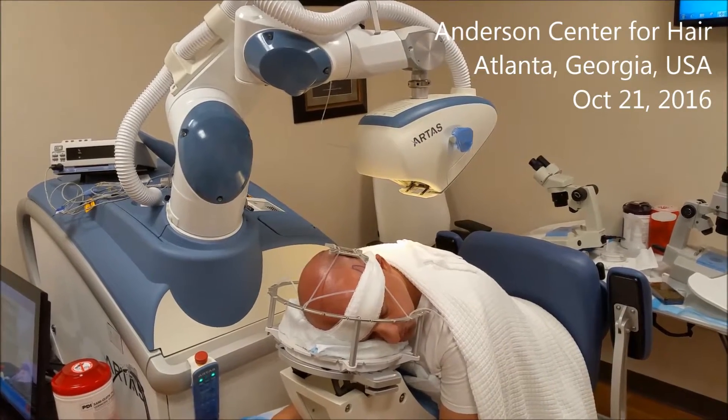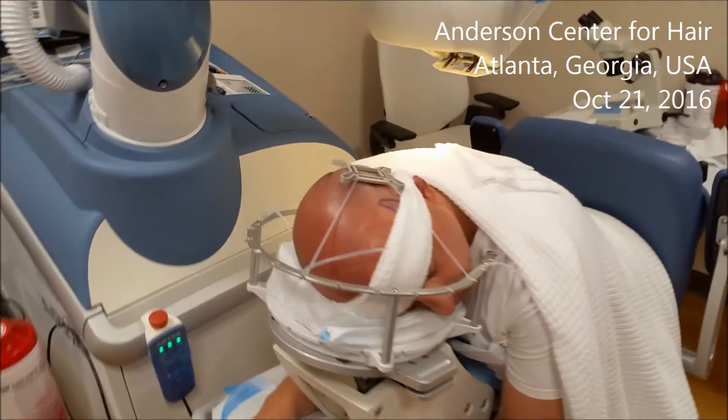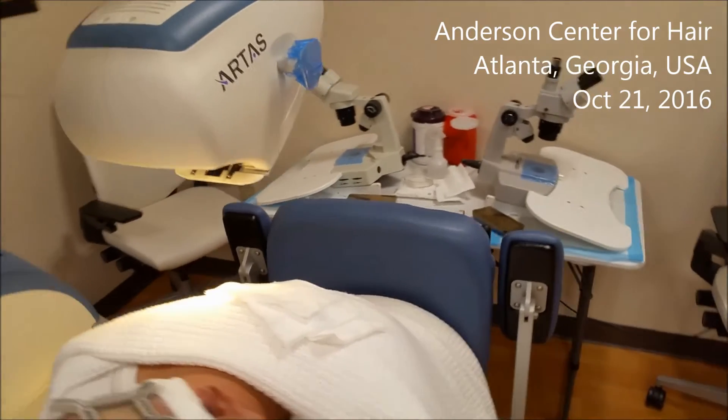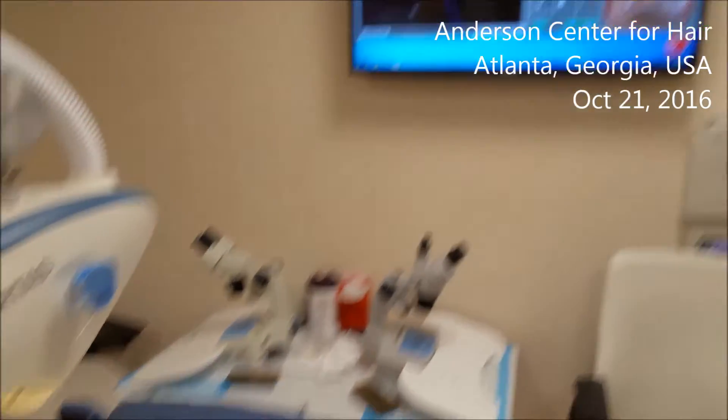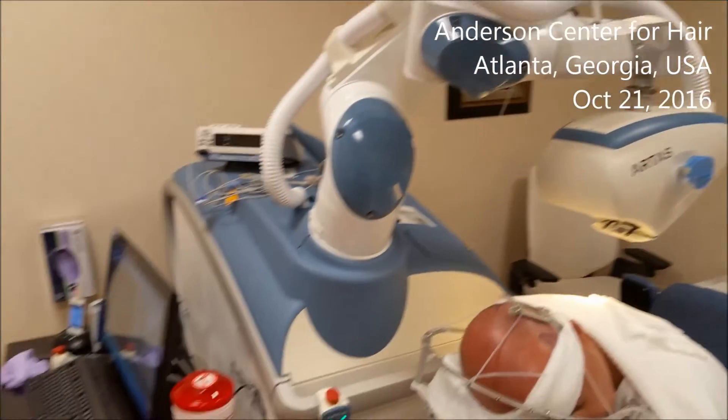Good morning. My name is Dr. Ken Anderson and we're here at the Anderson Center for Hair. We're about to start a robotic case as you can see. The microscope is ready, got the monitor ready, and of course the robot and workstation all set.